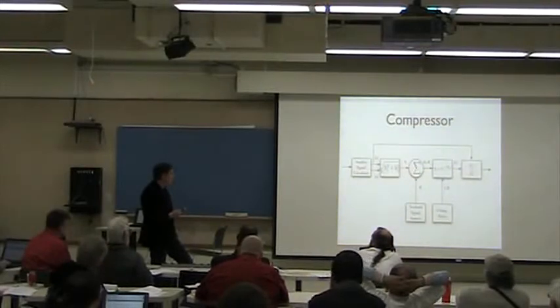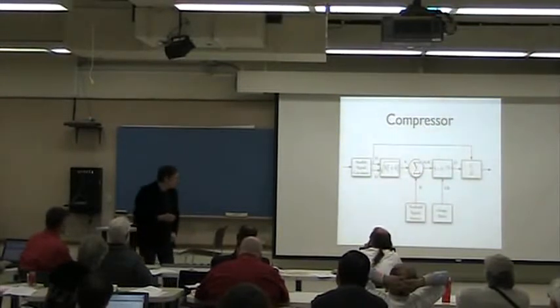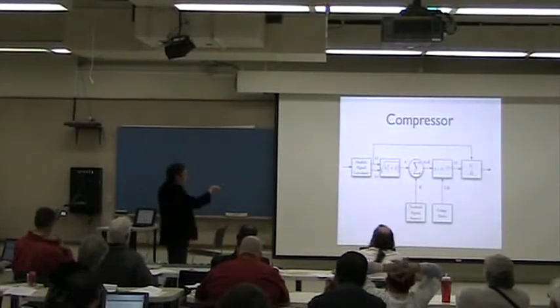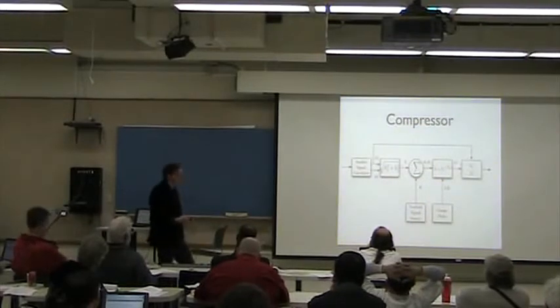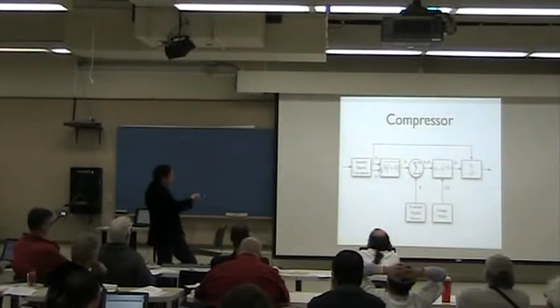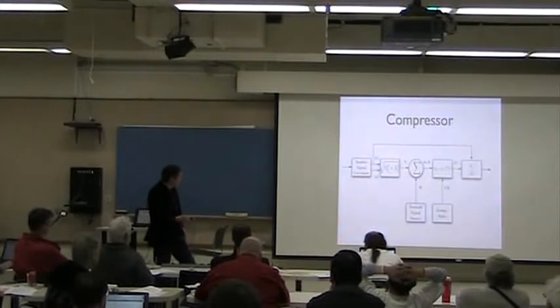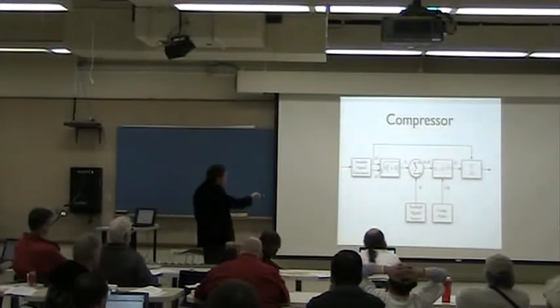And we had a pretty high precision requirement. So we had to calculate the magnitude with at least 18 bits of accuracy. So CORDIC worked for me pretty well in this case. So instead of this thing, we have CORDIC calculating the magnitude.